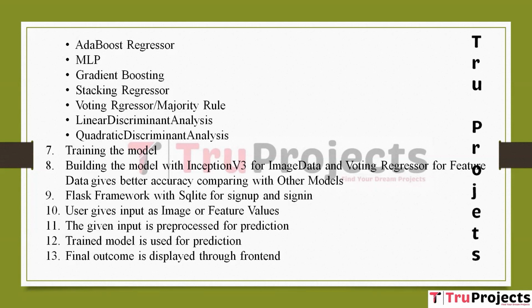Using the trained model for prediction. After pre-processing, the user's input data is fed into the trained models. The Inception V3 model processes image data, while the voting regressor handles feature data. These models apply their learned knowledge to the user's input, making predictions about sleep apnea based on the provided data, displaying the final outcome through front end.